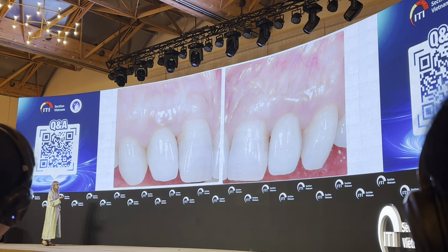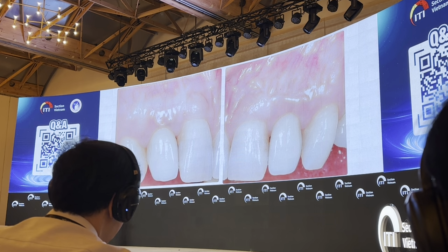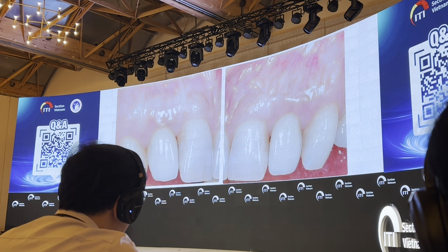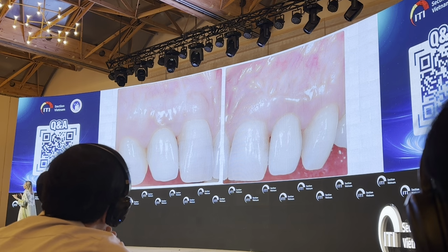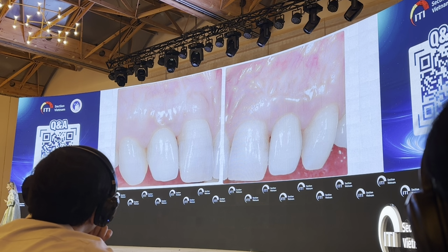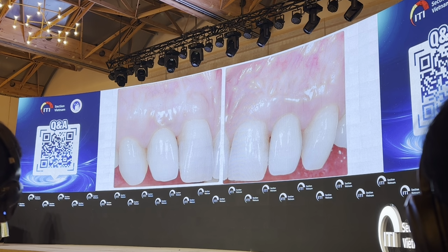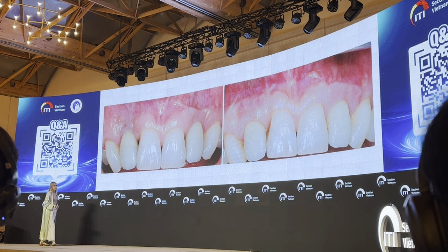And this is the healing, in which you can see we have the mucosal margin at both lateral incisors, which is now at the same level, in a more coronal position with respect to the margin at the level of the central. And from an aesthetic point of view, we wanted the lateral incisor shorter than the central incisor and the canine.